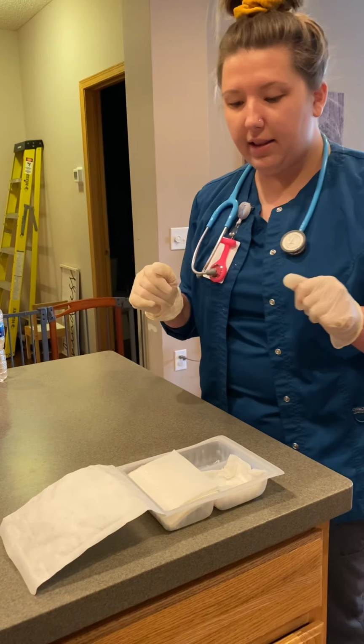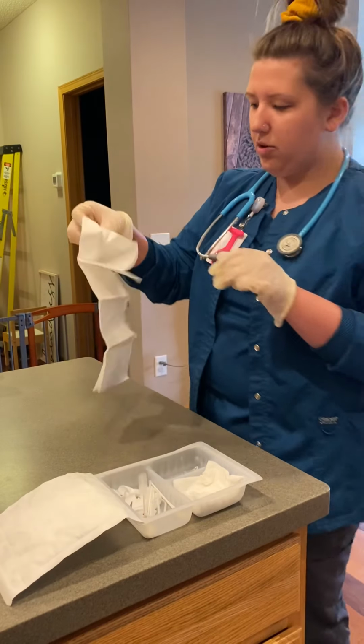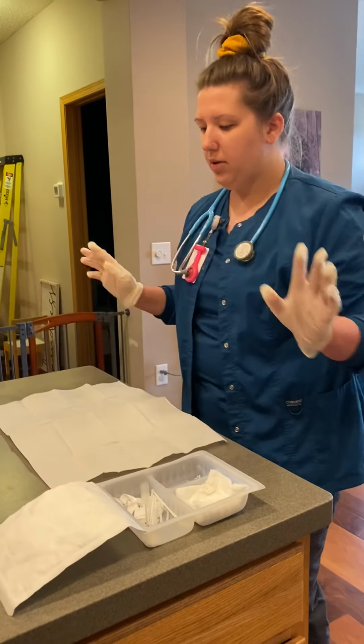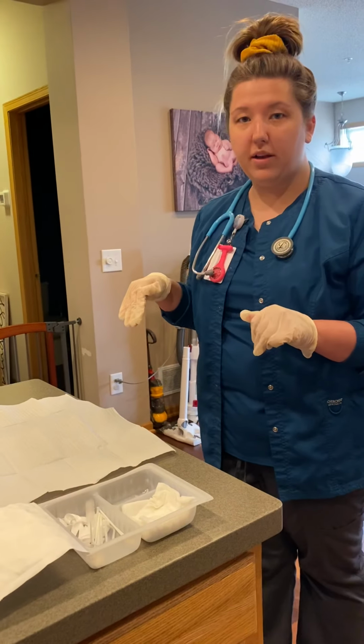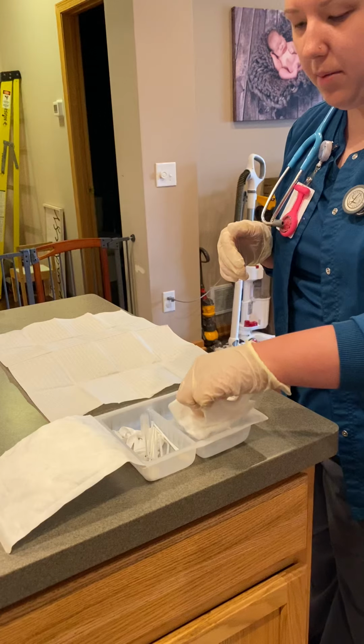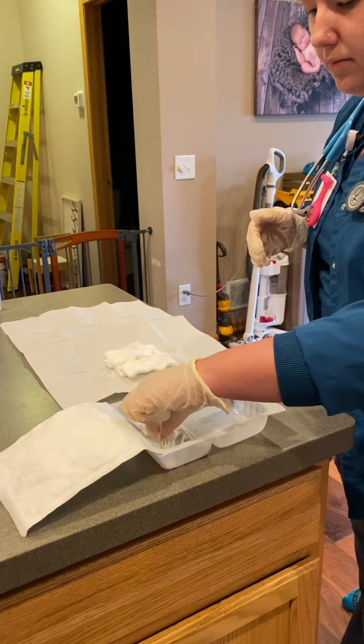Okay, so I have my sterile gloves on, and I'm going to get rid of this to maintain my sterile field here. And then now I'm going to get out my drape. So I'm going to take out my drape and open it up, and I want the shiny side down. So I laid that, and now I'm going to take out all my supplies. So I'm going to try to not contaminate my sterile field. Step around, toss my things on here.